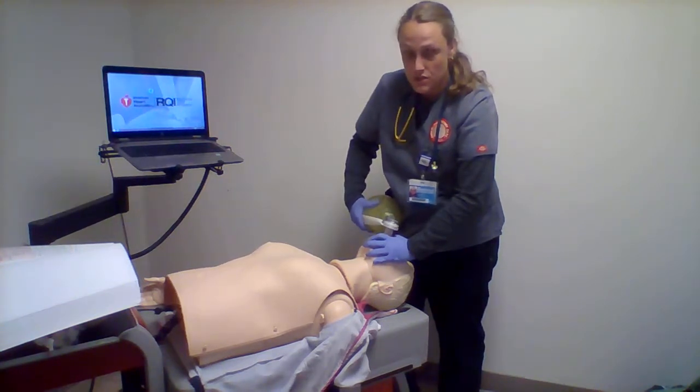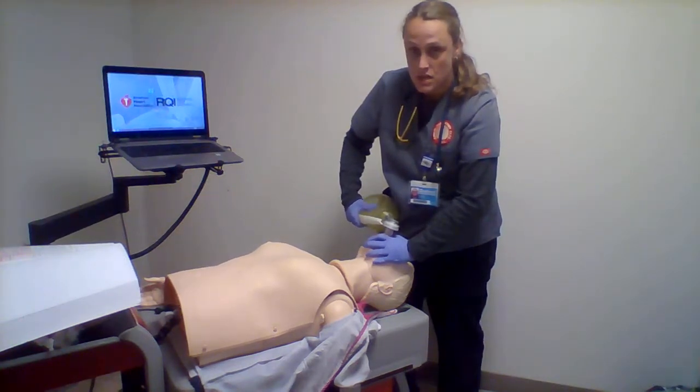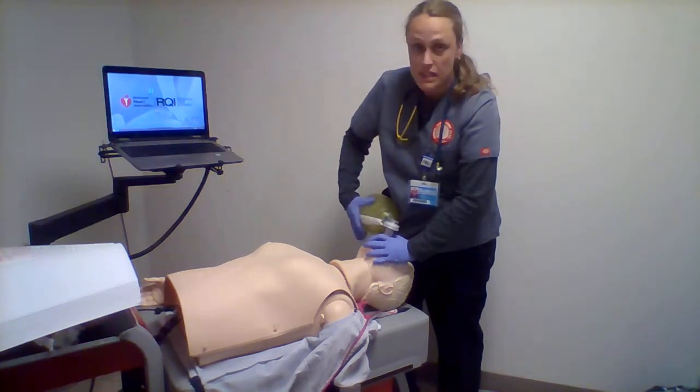I'll watch for even chest rise and fall. The bag-valve mask will be hooked up to 15 to 25 liters per minute. I'll do this until I get help.